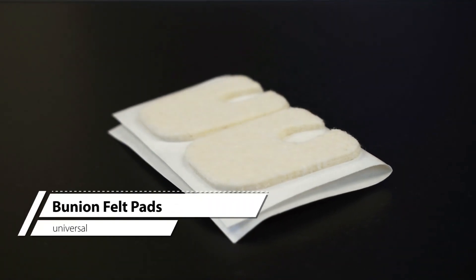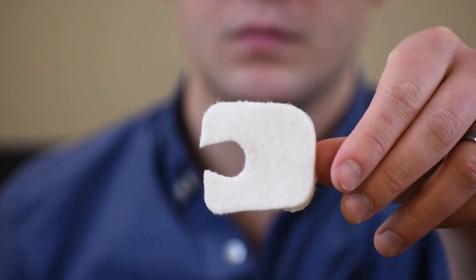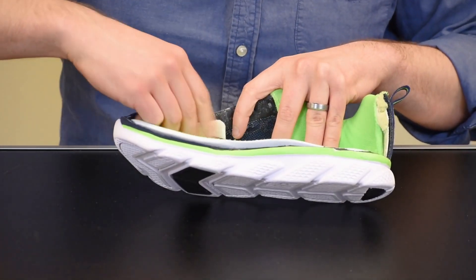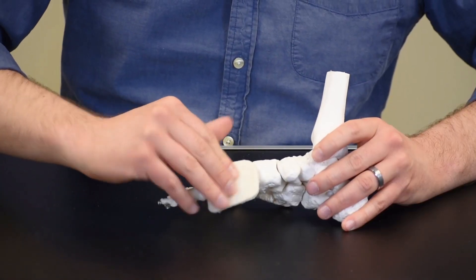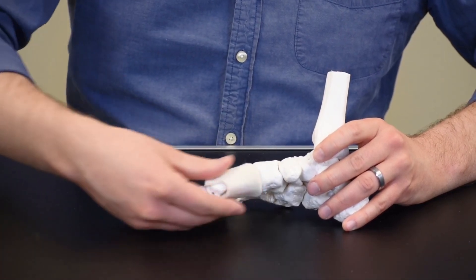Bunion felt pads are used to cushion and offset bunion pressure. These pads are universally shaped and sized. To apply, remove the adhesive backing from the cushion and place in the shoe or on the foot with the affected area positioned in the U-shaped opening of the felt pad. Adjust the position as necessary for comfort.